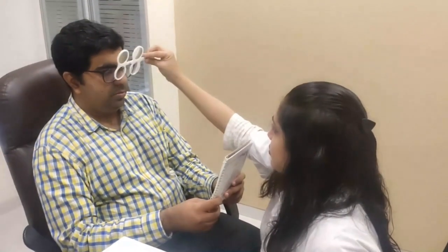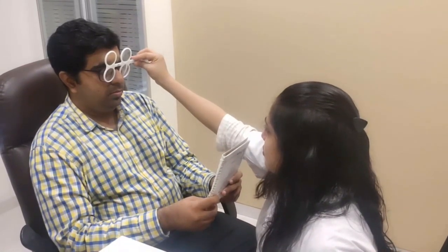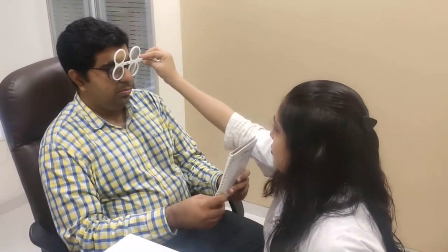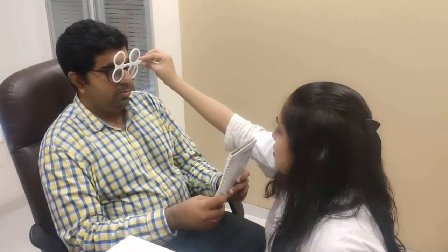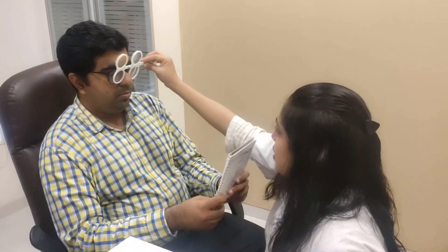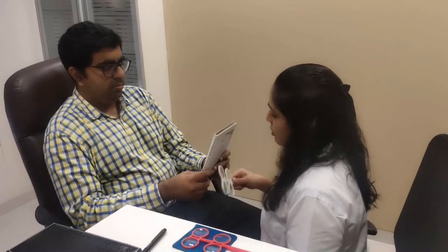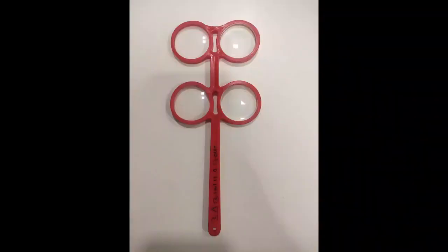No. You can see that the patient has difficulty clearing with minus lenses, which shows that he has difficulty exerting or stimulating accommodation for near at 40 centimeters.